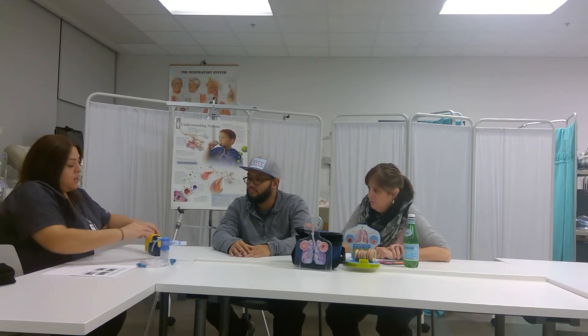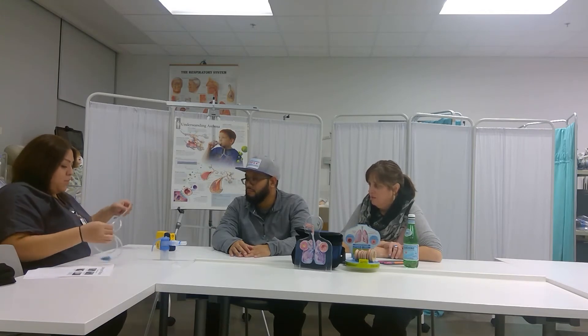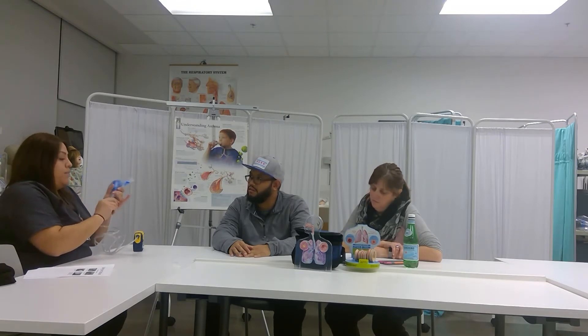So I'm going to get started. This is your air compressor. This one is battery operated, but they do have some that connect to outlets. This tubing goes into the compressor here — just stick it in here. This is your medicine cup. As long as you stick one end in here and then one at the bottom of the medicine cup. This one has the mouthpiece already connected to it, but you can take it off and put it back on.